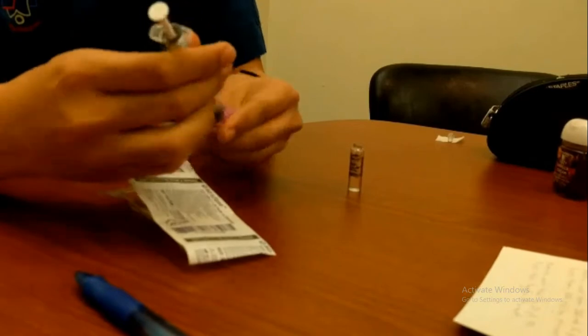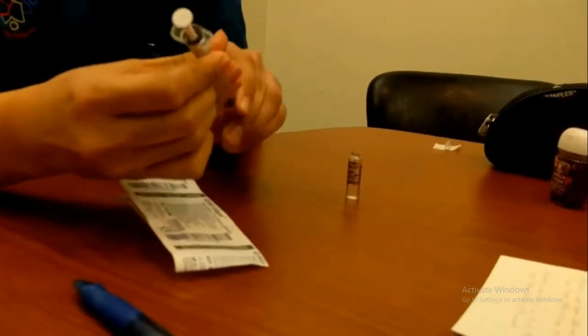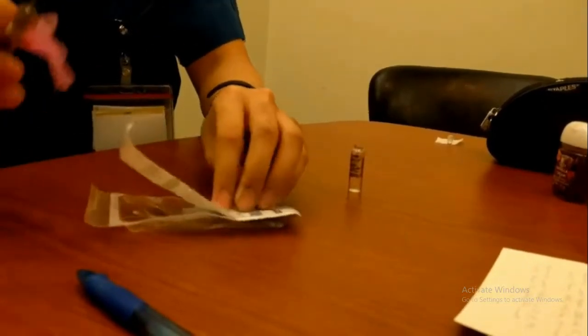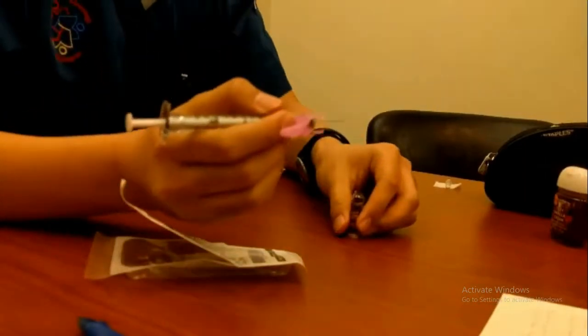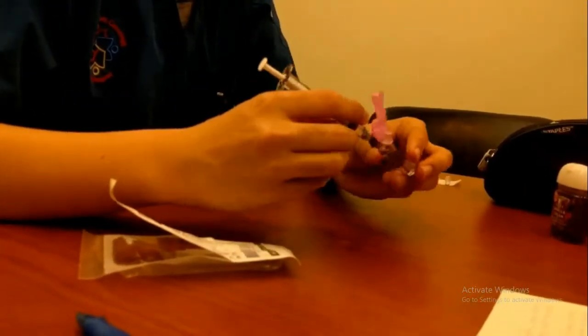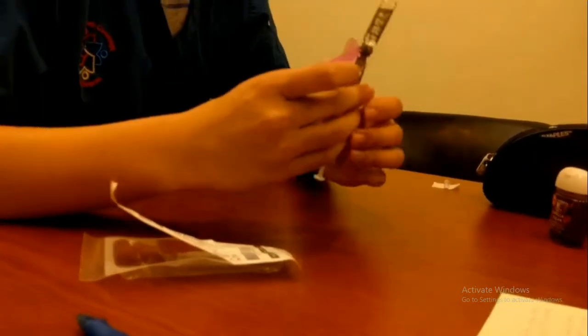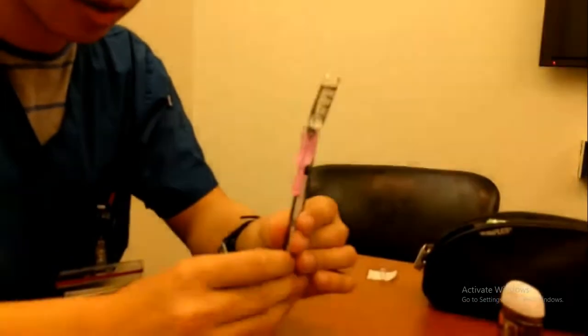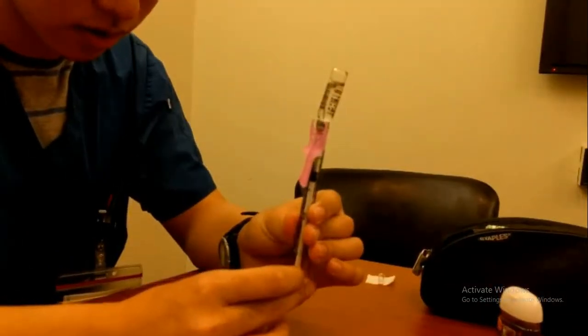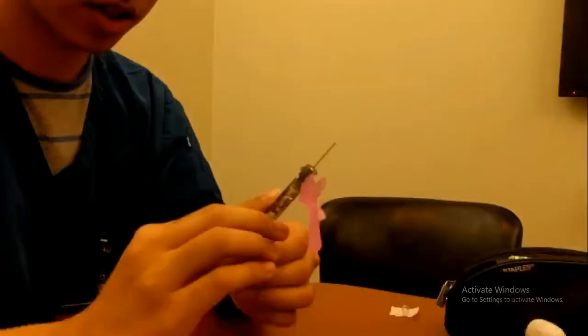Right. So now I'll be putting together the needle. I'm going to take my syringe, lock it onto the needle. I'm going to put this back. Take the cap. Remove the cap. Okay, and then I'll just be inserting it into the ampule without touching. And you don't need to aspirate air for this one because it is an open system ampule. And so I'll be withdrawing the fluid, injecting it into the air.